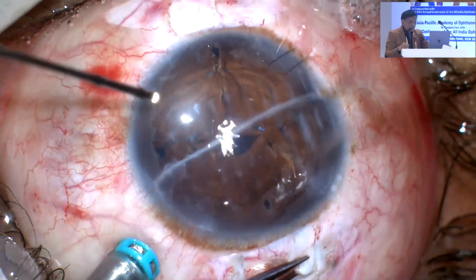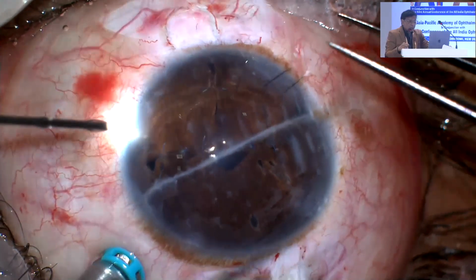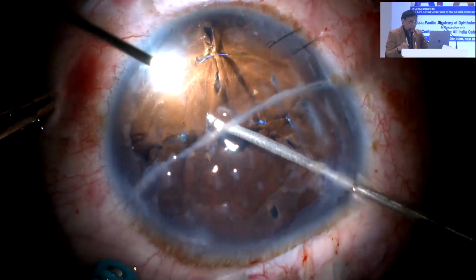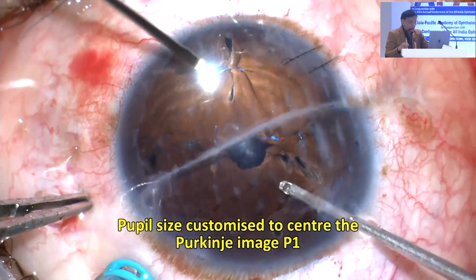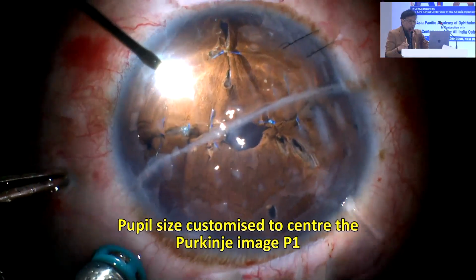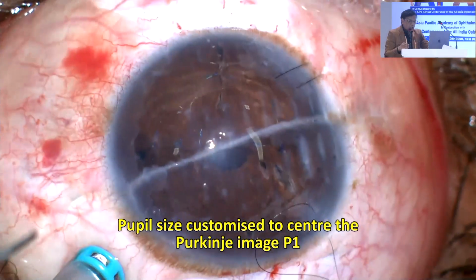Once that's done, now look what I'm going to do. I'm going to check the haptics. Once the haptics are in place, then take the vitrectomy probe. And you can see there, with the vitrectomy probe, decide and see whether you need to make that pupil the correct size or not. It has to be centered around the Purkinje image, and you can see it's approximately in the Purkinje image there. Once that's done, I now close this patient down.